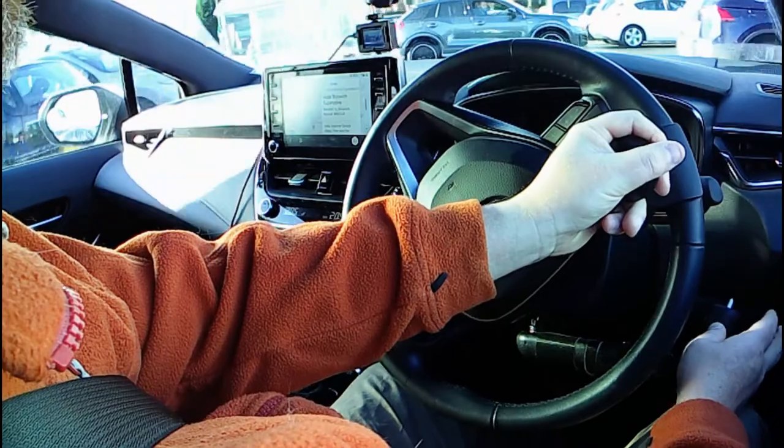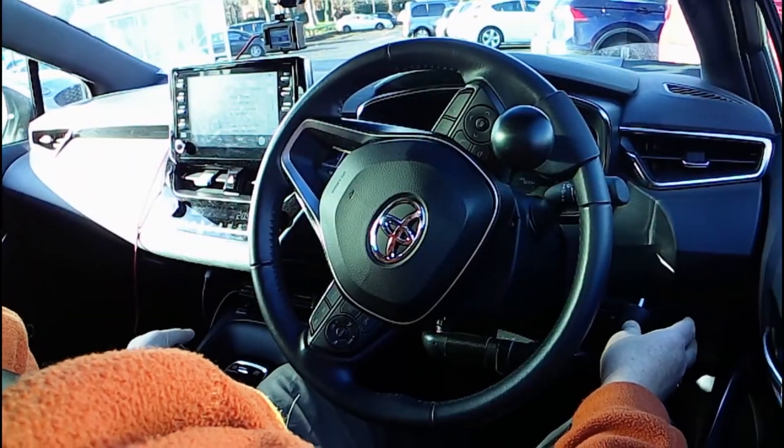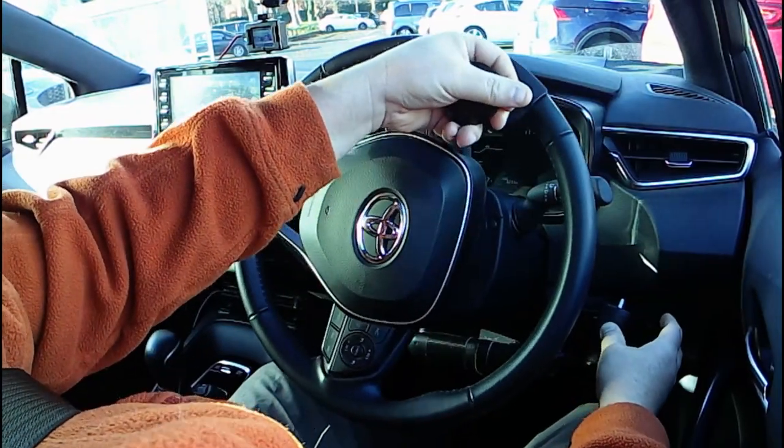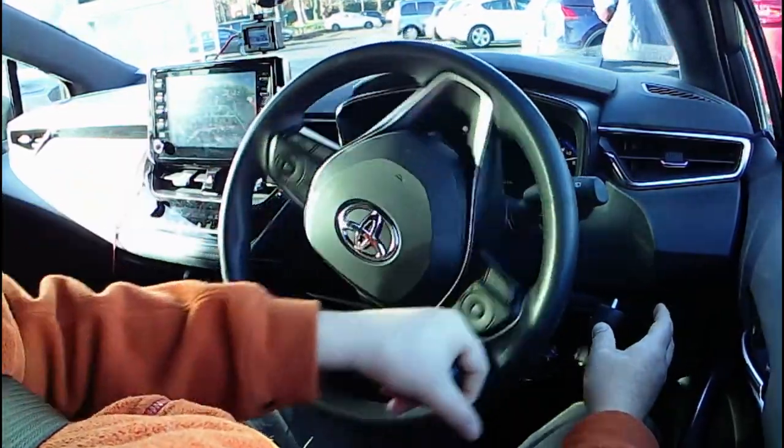For reversing, we make use of the creep of the car in reverse gear and control our speed just with the thumb.